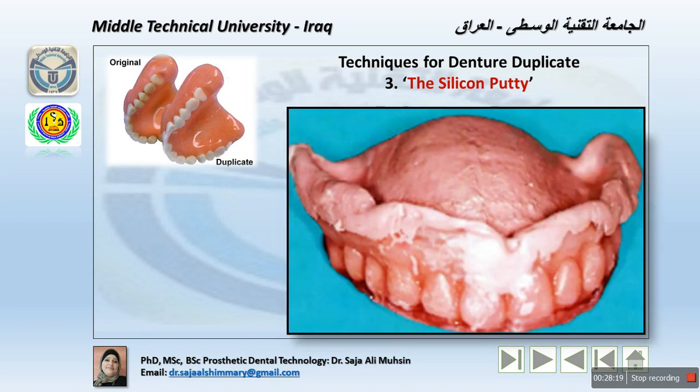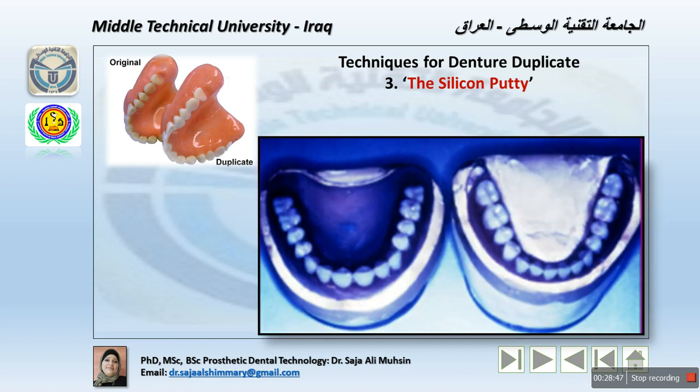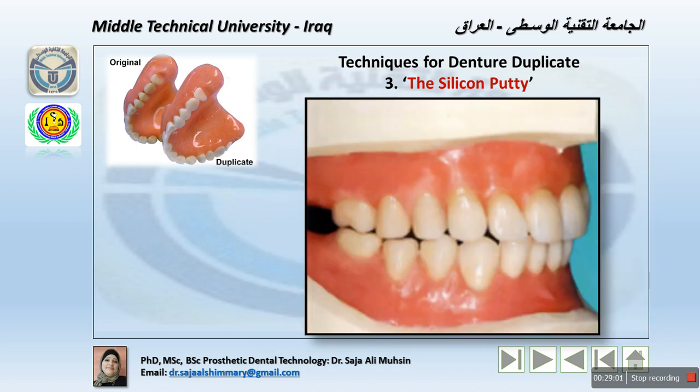Also, the upper reline impression is obtained after adjusting the occlusal plane level and the occlusal vertical dimension of the wax replica. The patient is checked for the occlusal vertical dimension, and after a while we take the wash impression or the reline impression. The duplicate dentures are then mounted on a suitable articulator to replace the wax teeth with the selected mold of the teeth, to make sure everything is perfect. Now, the tooth arrangement, tooth by tooth, is guided by the old denture. The placement is guided by vision. The relation of the ridges allows the new tooth arrangement to follow the original pattern. So it is the original pattern of the teeth, but the vertical dimension was corrected at this stage.